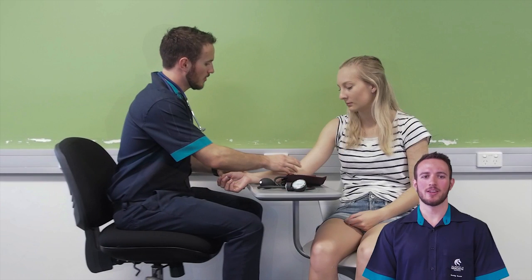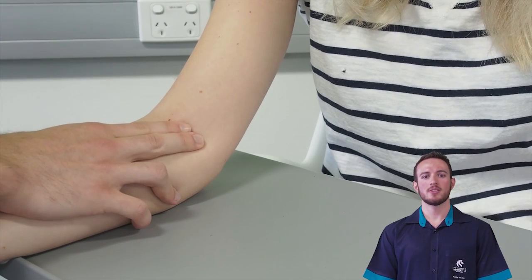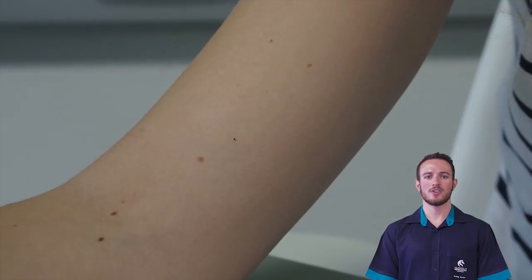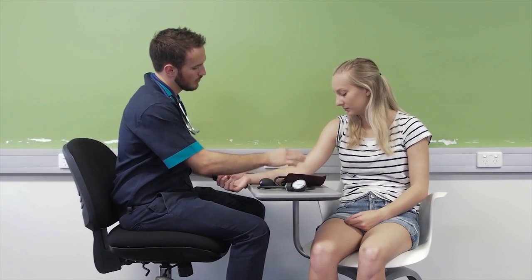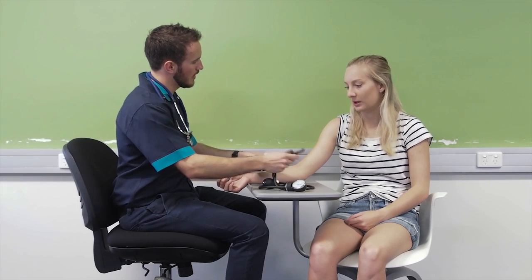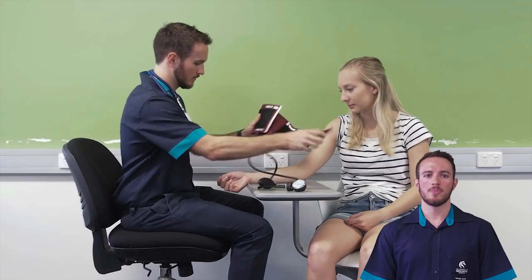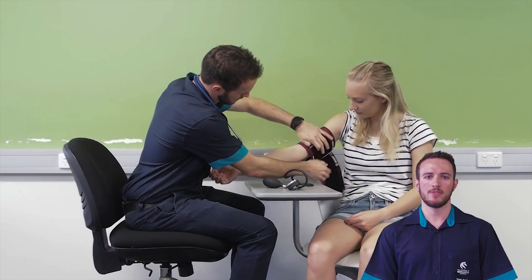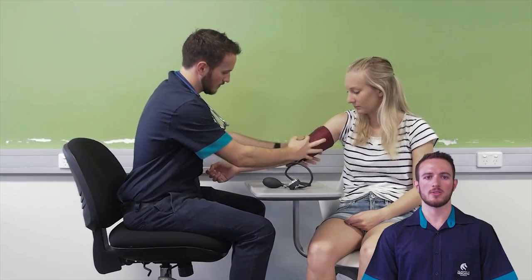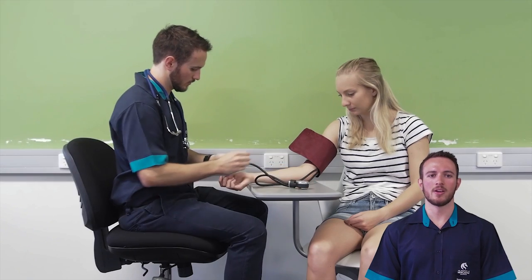Next, apply the cuff over the brachial artery, making sure the reading on the manometer is zero when fully deflated. Palpate to identify where you'll place your stethoscope, and use your guide to position the cuff directly over the artery. For initial assessments, preliminary palpation of the artery gives a rough estimate of the systolic pressure. Palpate the brachial artery with your fingertips while squeezing the bulb until there is no pulse, indicating that blood flow has been stopped. Take note of the reading on the manometer for later, then deflate the cuff and let the arm rest for one to two minutes.